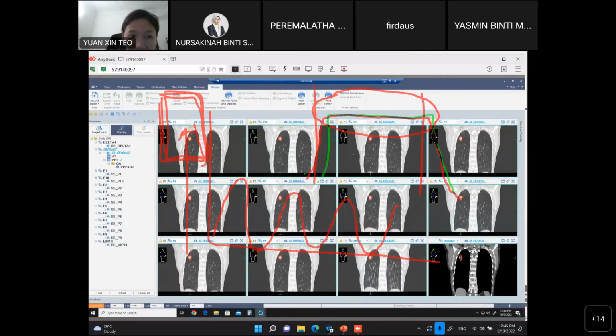So she cannot perform a good DIBH technique. So at the end, we drop this DIBH technique for her. So we will just practice using method 1. Okay, method 2 she can't.